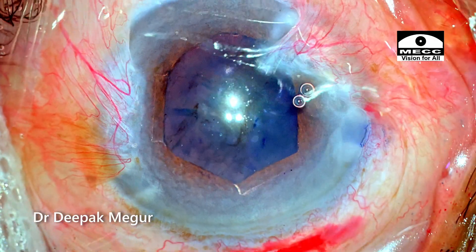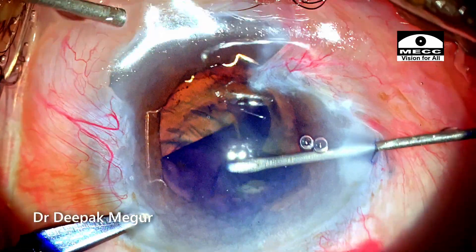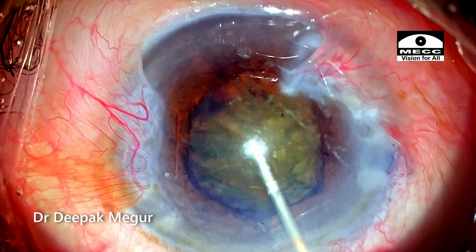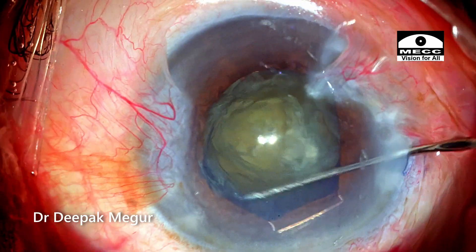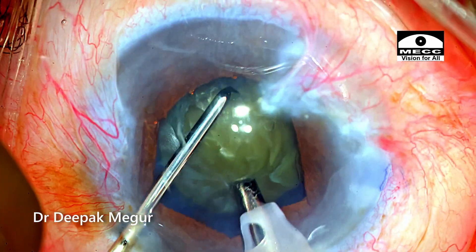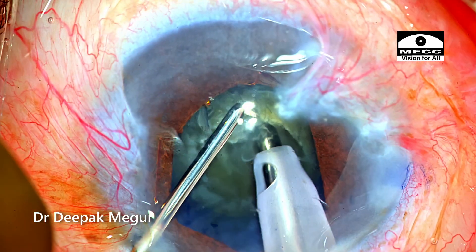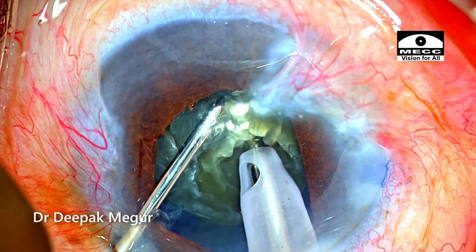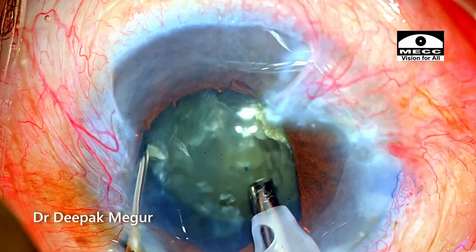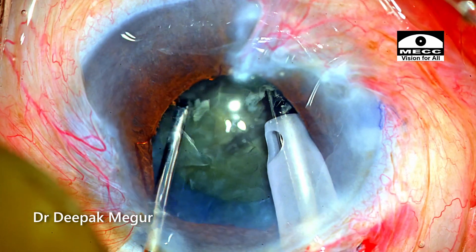Time to perform capsulorhexis. Once the pupil is well dilated and the iris is maintained in its place, most steps of the surgery become quite easy. Capsulorhexis of adequate size is created followed by hydrodissection. Nucleus rotation confirms that it is totally free from its attachment to the capsular bag. Time to emulsify the nucleus. The nucleus is around grade 3 to 4 and moderately hard. My typical strategy is to create a small trench initially so I can bury my phaco tip deep into the substance of the nucleus and then perform vertical chop. The nucleus is divided into smaller fragments and each piece is emulsified in a controlled manner.